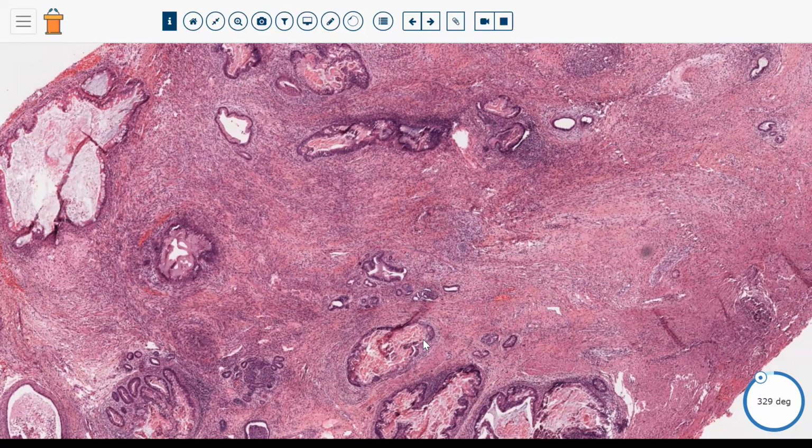If you have abnormal, impaired spermatogenesis, that is an argument that you have an abnormal testicular environment, and most likely that would be in keeping with a malignant germ cell tumor. You should not have microlithiasis or calcifications in the background seminiferous tubules, because again, that implies an abnormal testicular environment that is more in keeping with a malignant type of germ cell tumor. So most of the time, the distinction between prepubertal and postpubertal is somewhat obvious based on the age of the patient and the background testis.